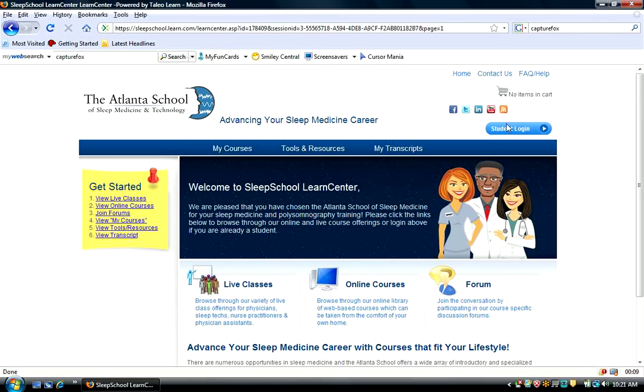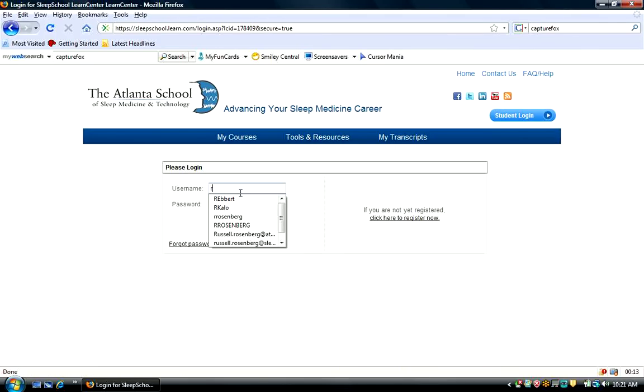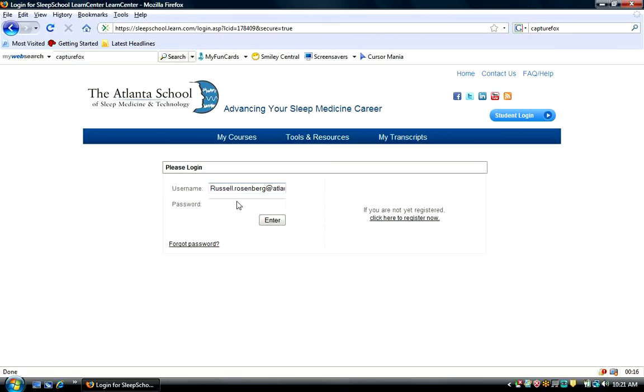First, I'm going to log in under student login, putting in my username and then my password.